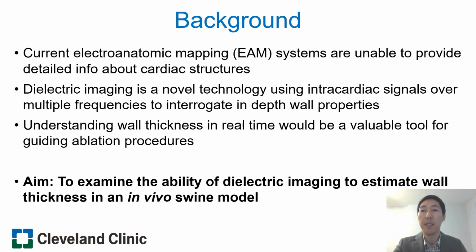Current mapping systems have gained widespread use in ablation procedures as they are able to relay cardiac anatomy, however, are limited in their ability to provide detailed information about cardiac structures. Dielectric imaging is a new technology which combines information gained from intracardiac signals over multiple frequencies and can potentially be used to understand tissue properties, such as wall thickness. To understand wall thickness in real time would be a great benefit in guiding ablation procedures.